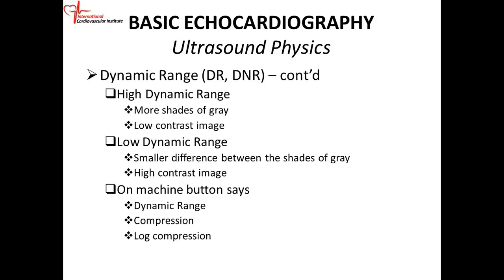All right, so this is the fourth and the final section in ultrasound physics. This week we're going to look at dynamic range, and the biologic effects of ultrasound, and we'll wrap up everything looking at the biologic effects of ultrasound.